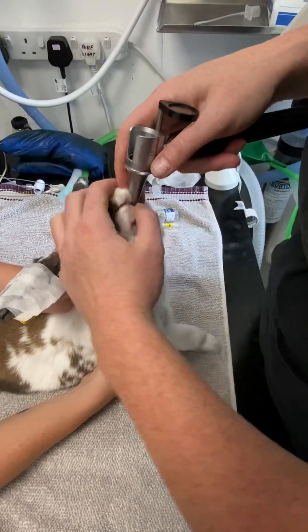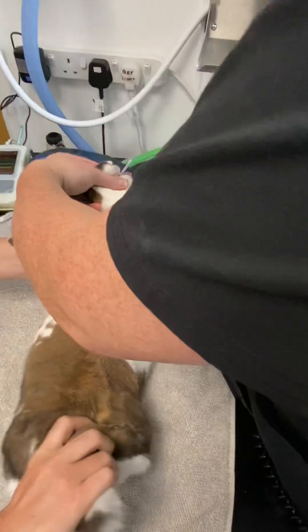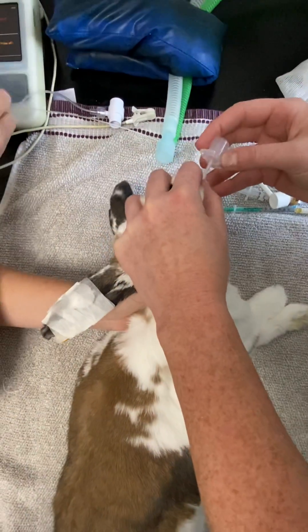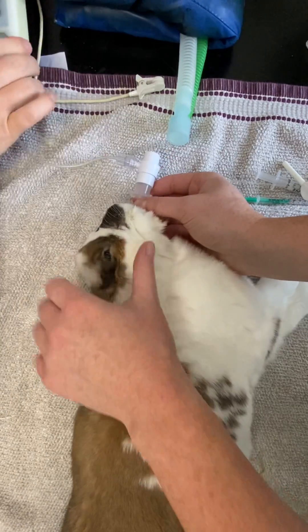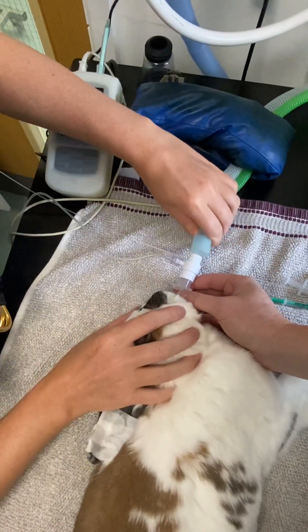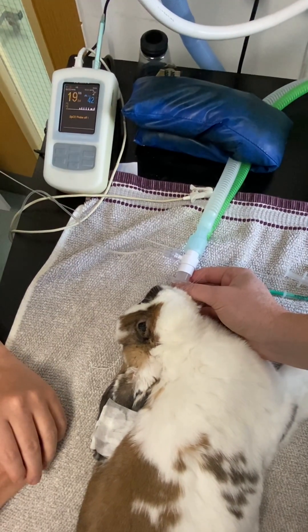We can then remove the stylet, holding the tube in place. Check that it's in place by placing the capnograph on the end of it. We're going to move this tube as little as possible so we're not traumatizing anything — and as we can see here, perfect: the trace is going up nicely, and that's it.